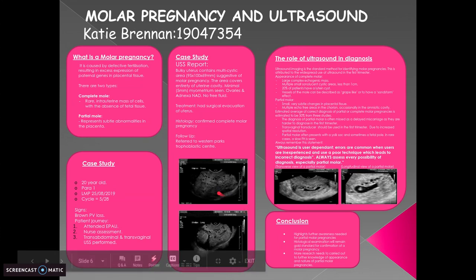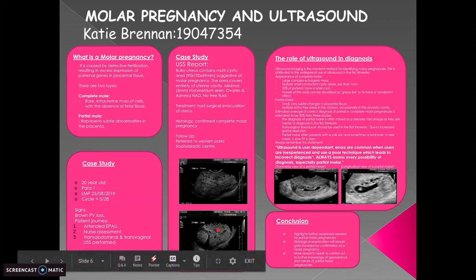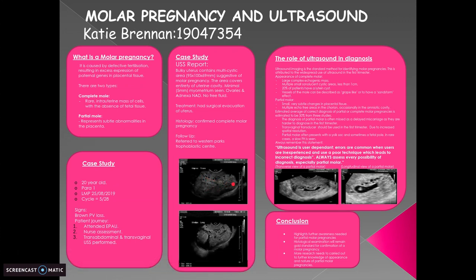The appearances show a classic complete molar pregnancy, as you can see a large mass in the uterine cavity with small cystic structures resembling a sandstorm effect. This characteristic was first described by Donald in the 1960s.